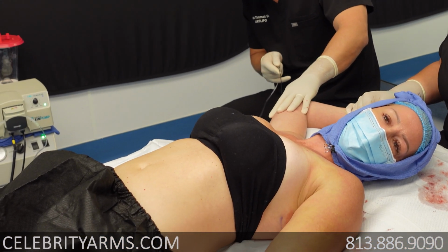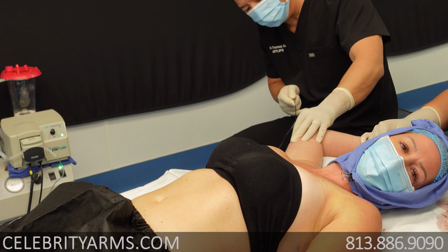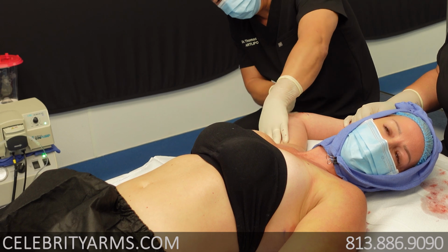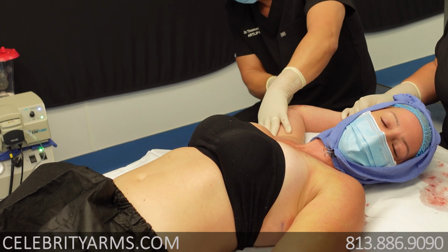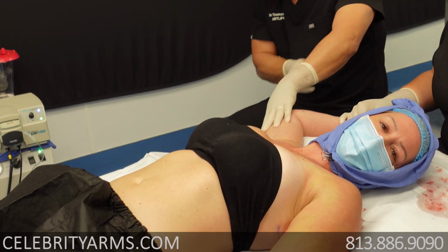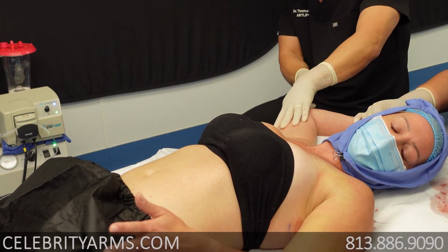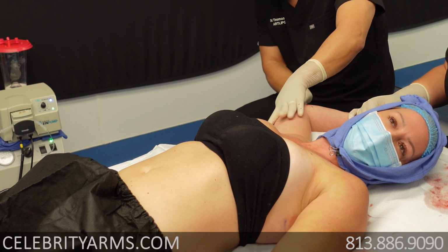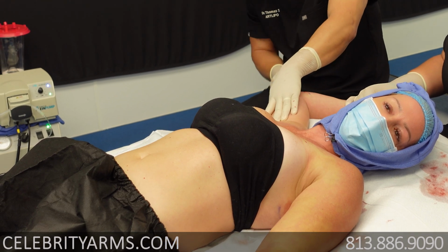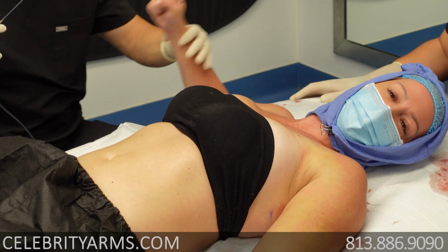Yeah. And some patients will have some pain. The pain is like a little prickly, stingy type of sensation if it's going to be there. But some people don't feel much of anything, and some people are a little bit more sensitive to it. So we do have some patients that are like, ooh, I really didn't like that. But at the very end of things, it's usually more weird than anything. Well, my left arm was done already, and as you got closer to finishing, I really didn't feel much of anything at all. Correct. But I'm not tensed up, only because you want my arm to be.